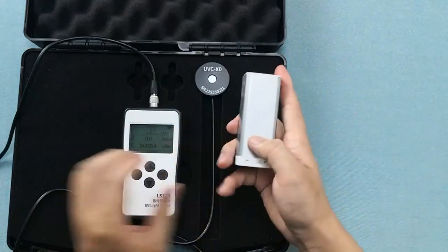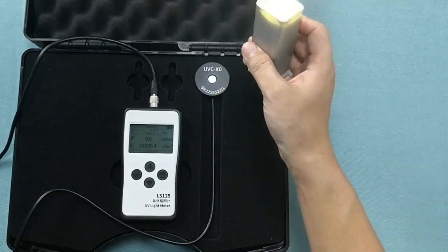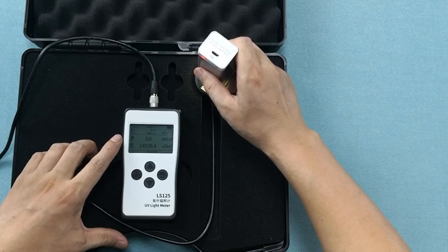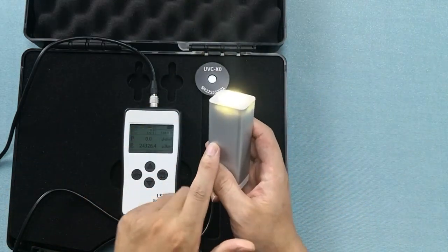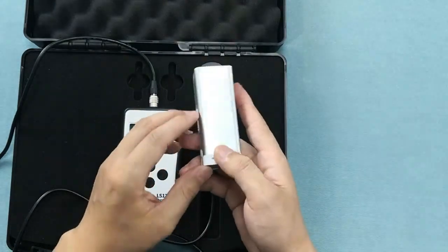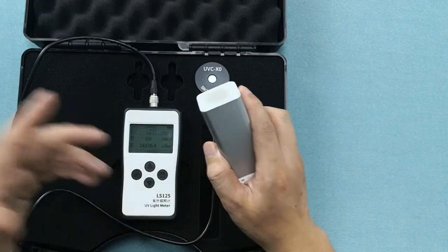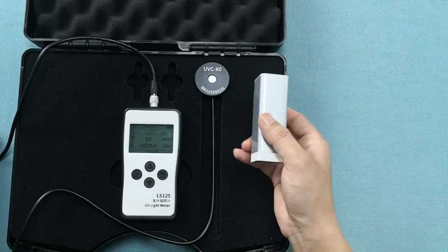Now let's do the LED. Press twice, and the intensity value is back to zero. Bringing it closer to the probe, you will see the number zero — no matter how close I bring it. That's because this is an LED light, not a UVC light. Even though from our perspective this LED light appears much stronger than the UVC light, this filter only allows the 254 nanometer wavelength through, and this LED light does not put out any 254 nanometer wavelength rays. So no matter how close I bring it, the number is always going to be zero.